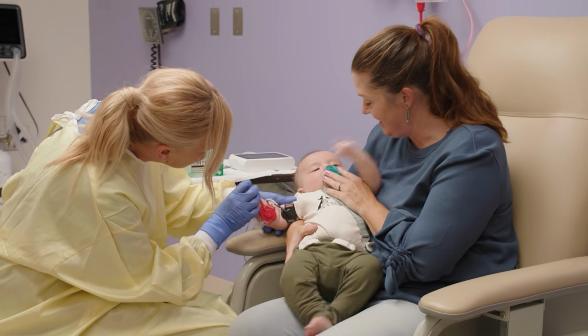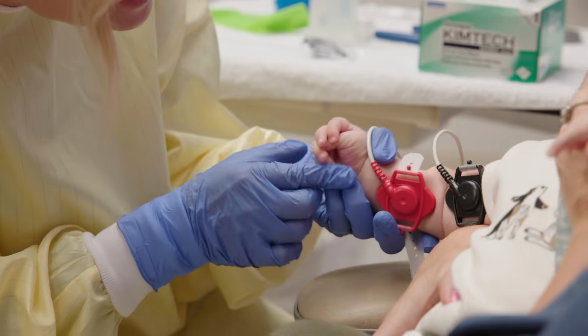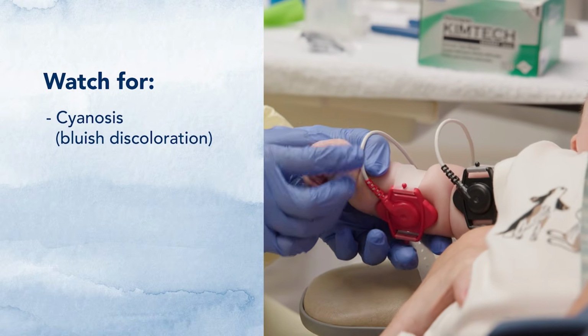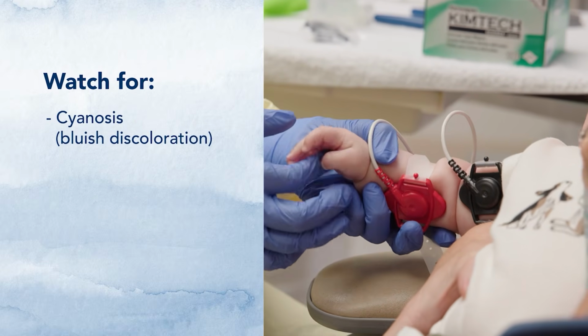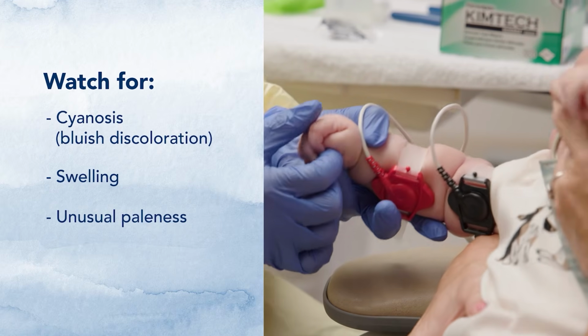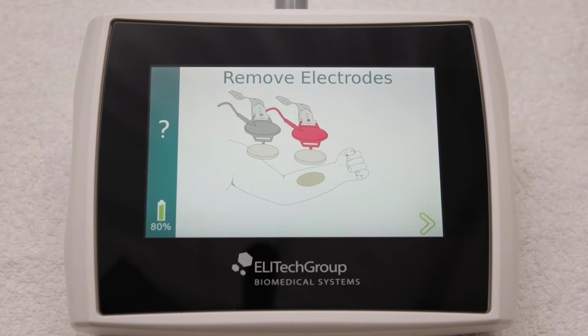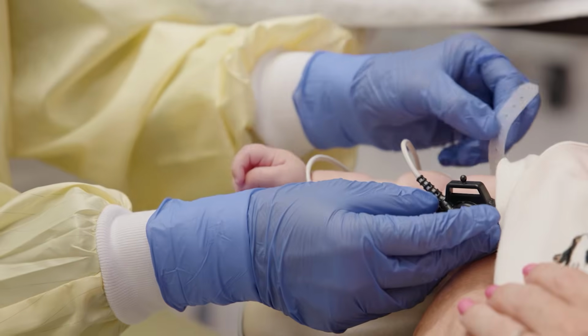Also, monitor the limb closely throughout the stimulation period for any signs of impaired circulation, such as cyanosis, bluish discoloration, swelling, or unusual paleness. If any of these signs appear, stop the test immediately. Once the induction is complete, remove the black electrode first, then the red electrode.